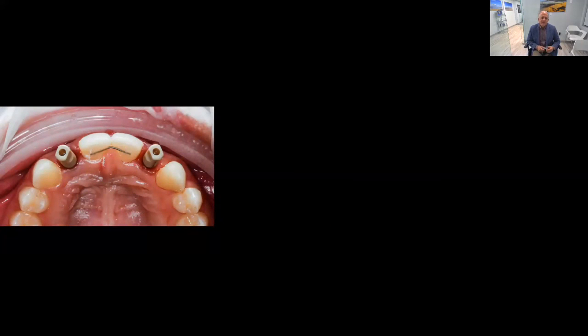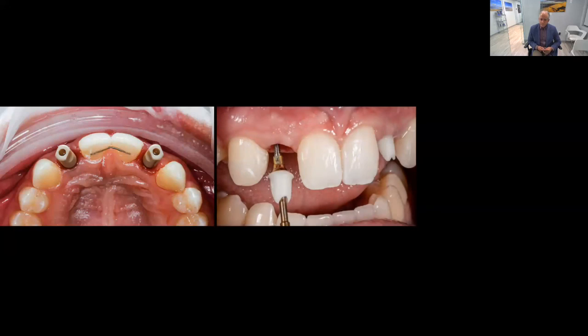In a situation like this, if I'm not doing this in-house, then what I'm going to use are abutments that my lab likes to work with. And in this situation, they're true abutments. And it's just easier for labs to use software on their end, capturing analogs or scan posts that are of this variety. So these are true abutment scan posts inserted in those two implants and then scanned.